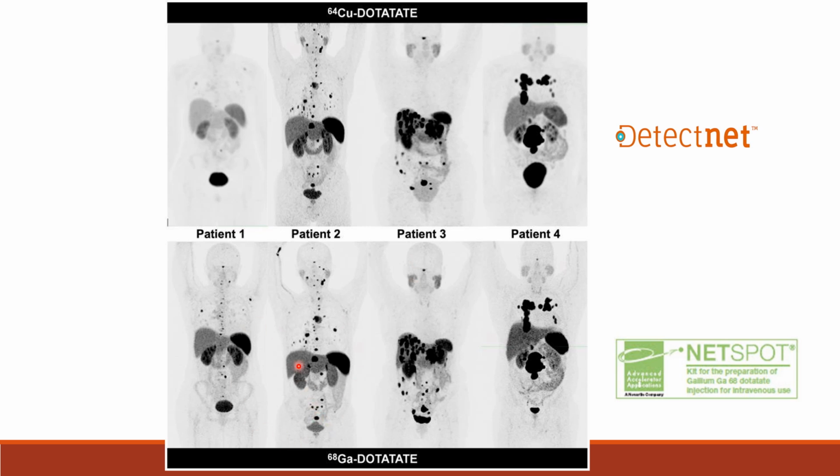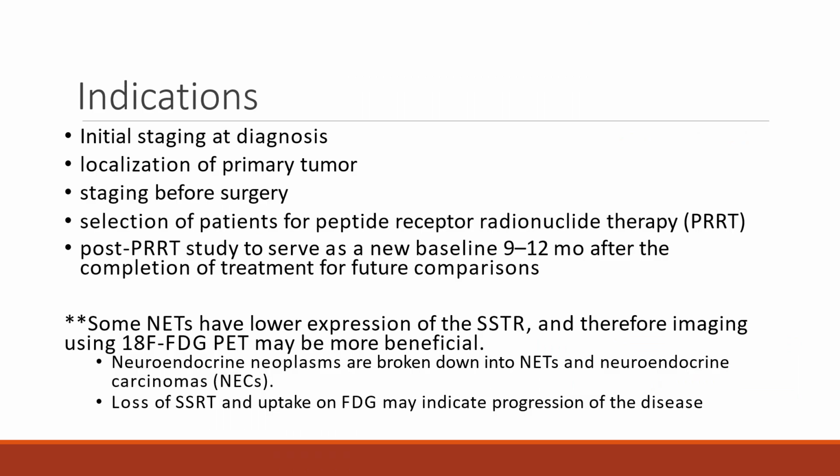Lower radiation dose to the patient, but if it was me, I would want the test that's going to pick up more of the cancer spots and show better sensitivity and resolution, and I would just take the hit on the radiation dose because I've had enough in my life anyway. What's one more little gray? So that would be me if I was the patient, but you do have a lower radiation dose with gallium. It is more widely available, things like that.